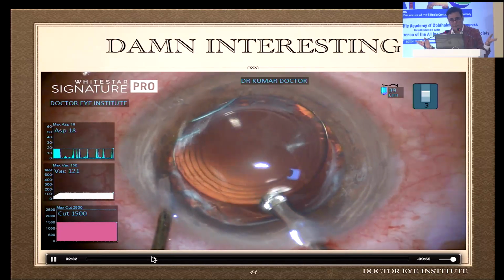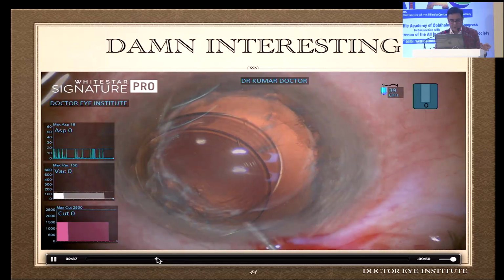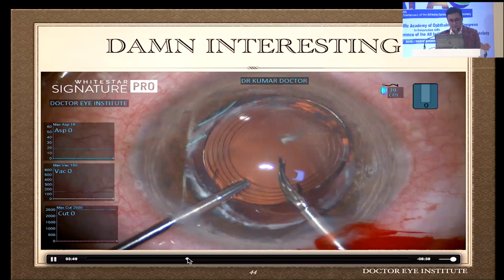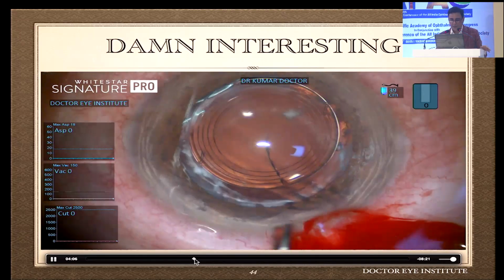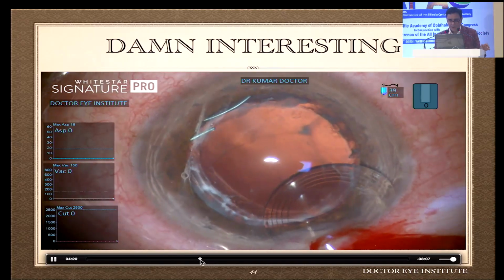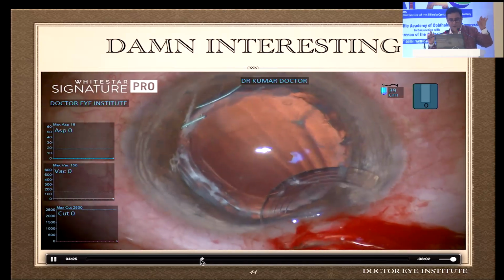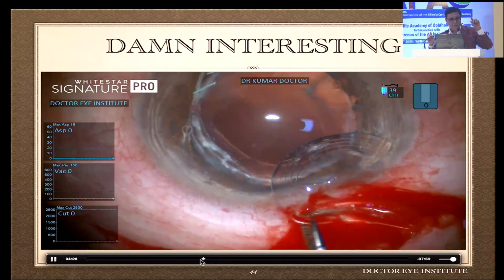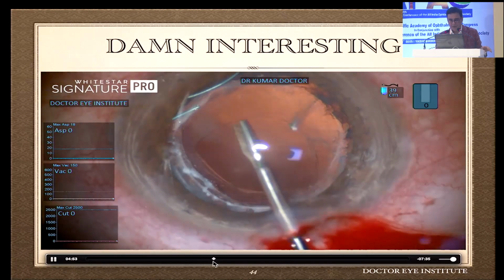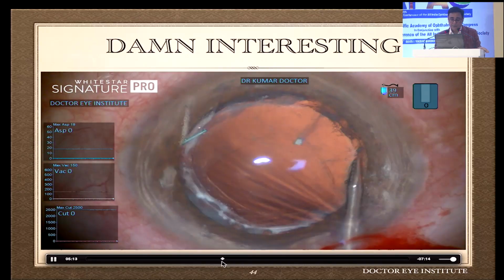Now, whenever you want to explant something like this, it's very, very important that you hold the disc, okay? So you need micro-grasping forceps, and once you hold the disc from one side, you need micro scissors, and you don't need to cut through and through. As you all know, you cut only halfway, and then use the incision as a fulcrum, and like a Pac-Man, you just hold one end and rotate the whole lens out. Now you can see that there are two haptics. One haptic is in the sulcus, one haptic is in the fused anterior posterior capsule complex. So you can see that it is lying there. So this is how I remove the optic, and once that is done, I remove the other haptic which was floating in the sulcus. And now the question is, the patient wants multifocality.